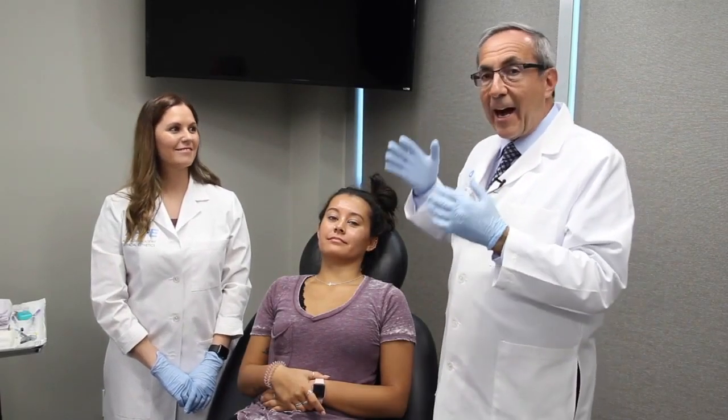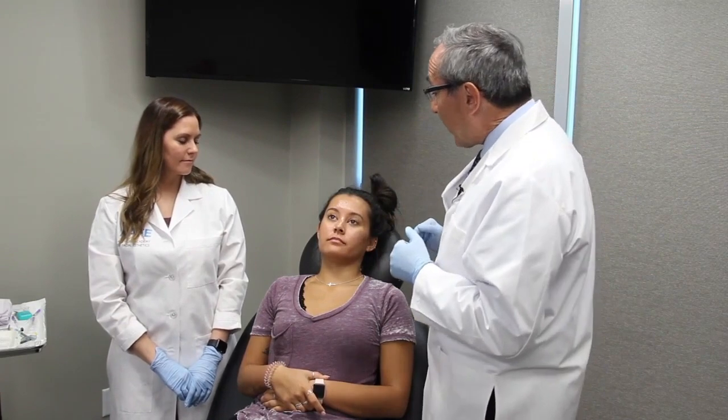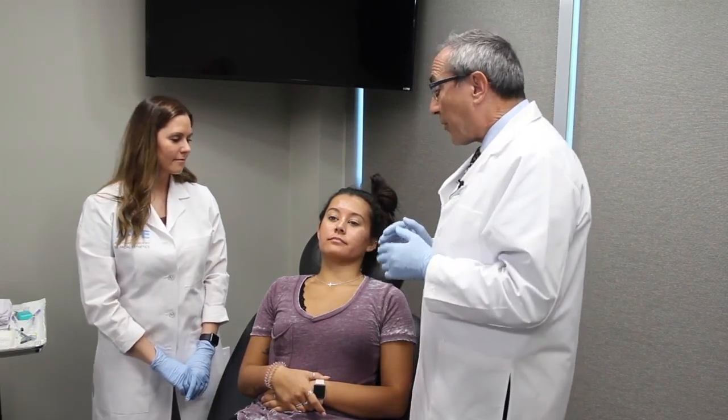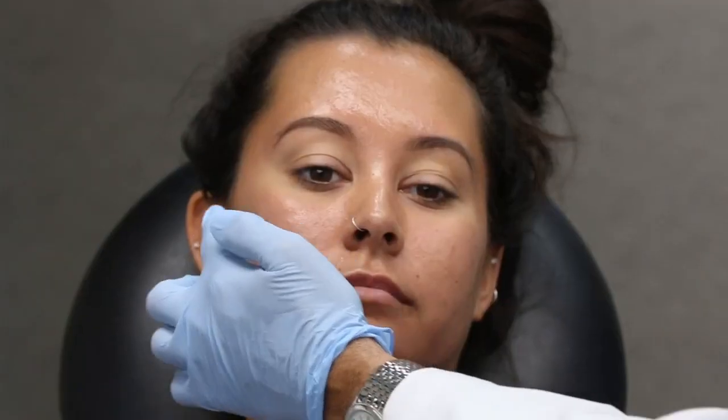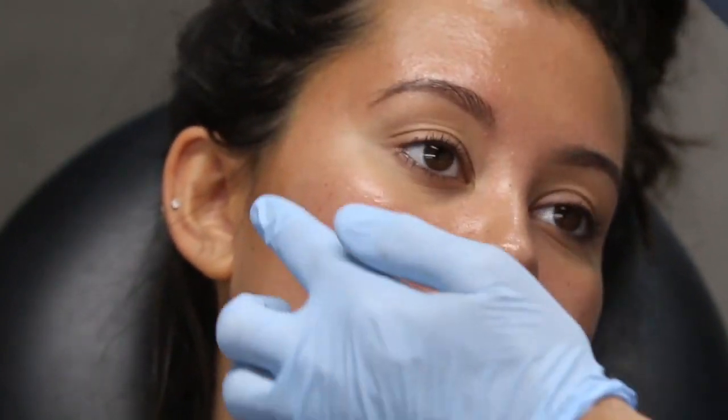Nicole is our patient today, and Ashley, who is our AAFE faculty member, has been treating Nicole, and I just wanted to show you close up what is going on here. What we've done on her are solid filler smooth PDO threads here. And what that means is, imagine that you have a dermal filler that's in solid form, little thin strips or threads of this filler here, and I'm just going to turn you this way just a little bit here.